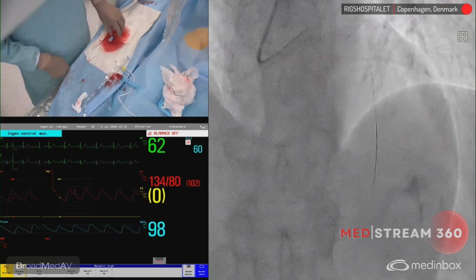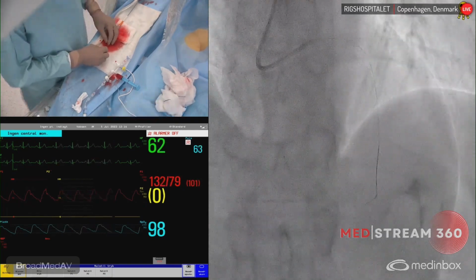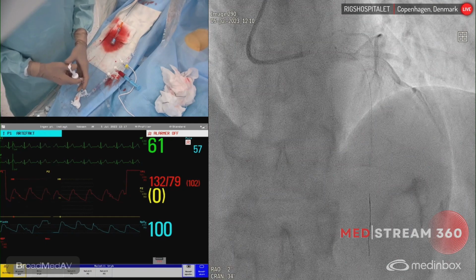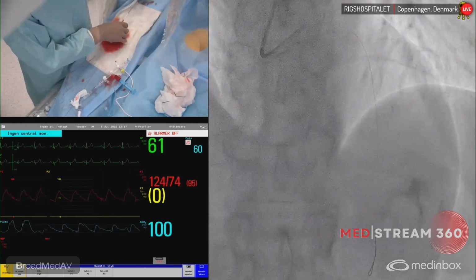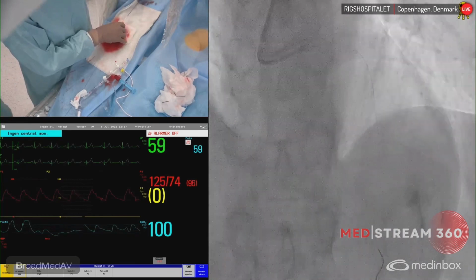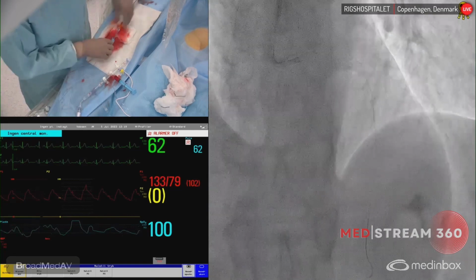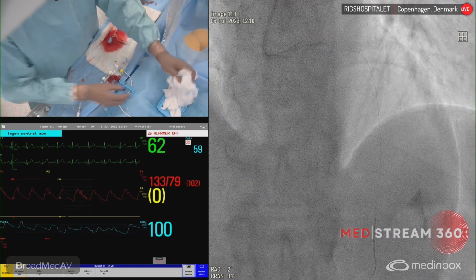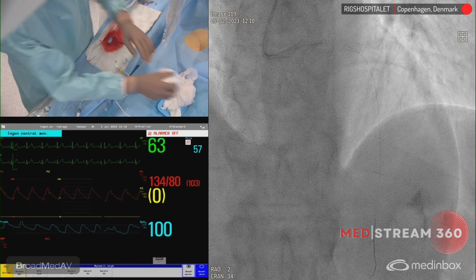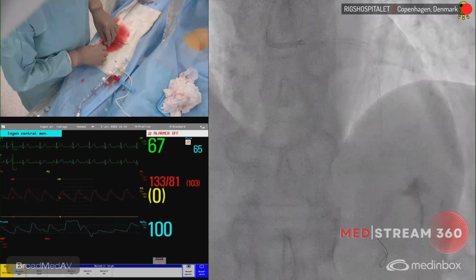And if you're just doing the cine without contrast, can you see where the catheter is located? What it's doing is to position the catheter without ruining the stent. Either think about using a guide extension and balloon to drag the guide extension in, but I don't think it's safer to guide extension and drag it over a balloon. So bring down the guide extension, then go with the balloon into the vessel, position the guide extension over the balloon because you have a risk of harming the stent.